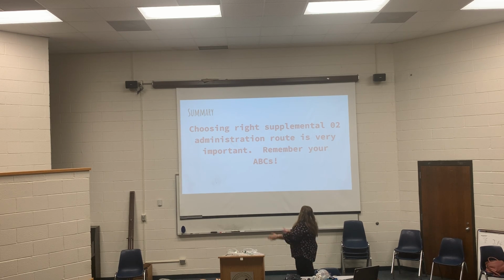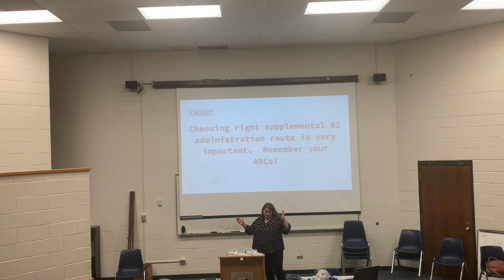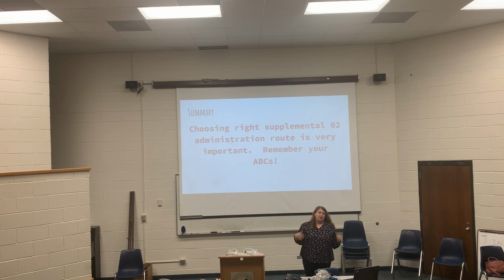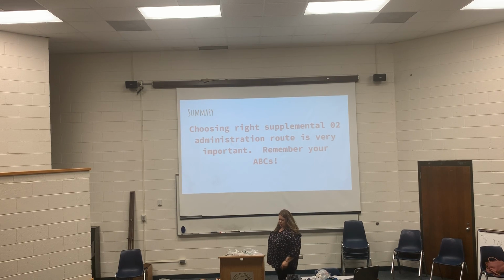Choosing the right supplemental oxygen administration route is very important. Remember your ABCs. A, airway. And if it doesn't work, try something else. I'm not saying, tell your partner to cry, but if you can't get a good mask seal, you definitely want to get that airway, and especially for pediatrics, that's like the very most important thing.